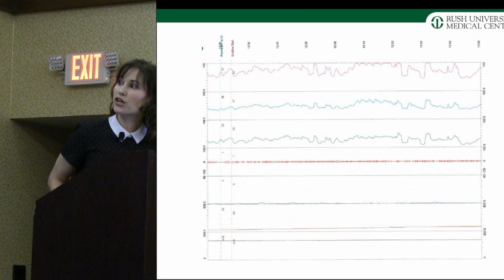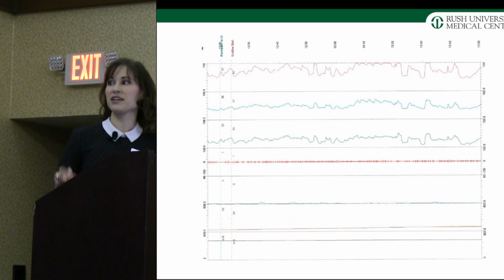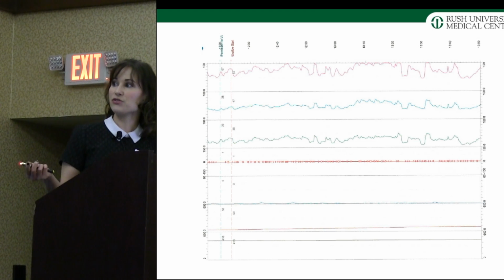So this is her urodynamic study. We gave her permission to void. Nothing's happening, nothing's happening. So again, she's using her abdominals here to try to push the urine out, and we got little baby flows down here, just drip, drip, drip.